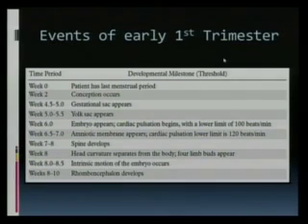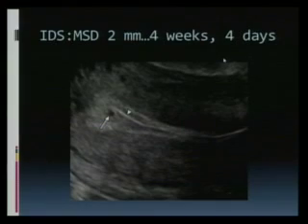At 8.5 weeks, you might see the embryo jump. Maybe it's having some movement. And by 8 to 10 weeks, remember this is 8 weeks head curvature, body, limb. 8 weeks early intrinsic motion. 8 weeks a rhombencephalon develops. What's a rhombencephalon, Yemezi? Good, the posterior brain, unsegmented brain or cerebellum.